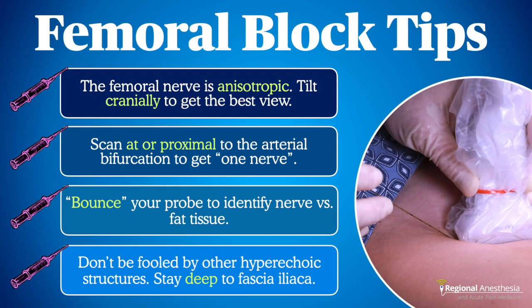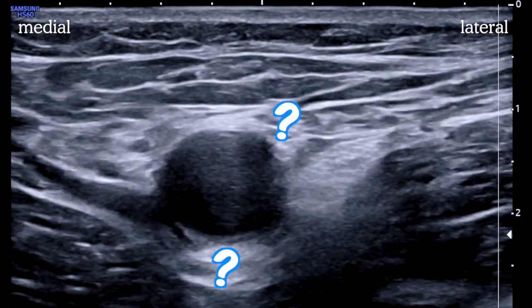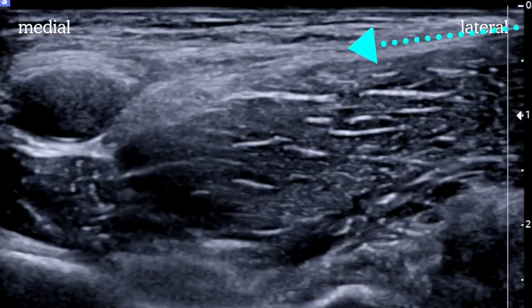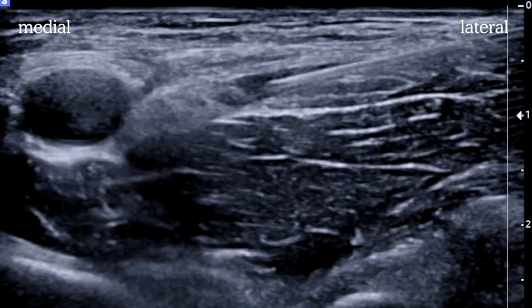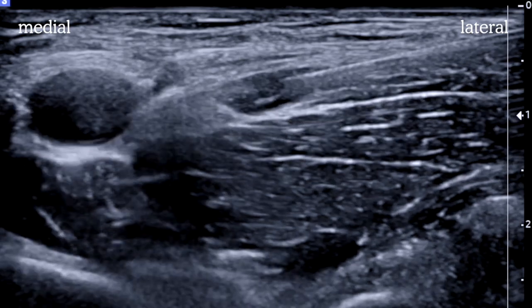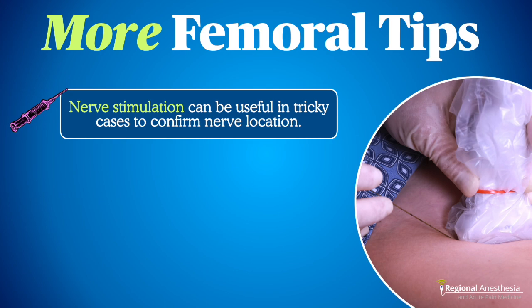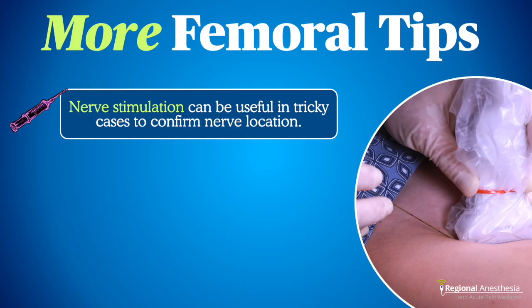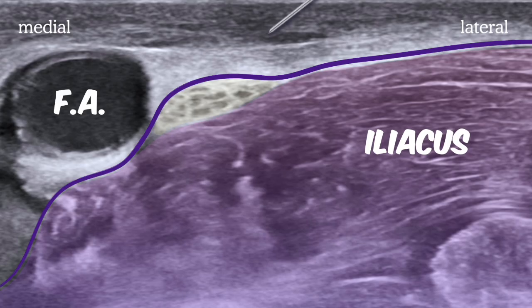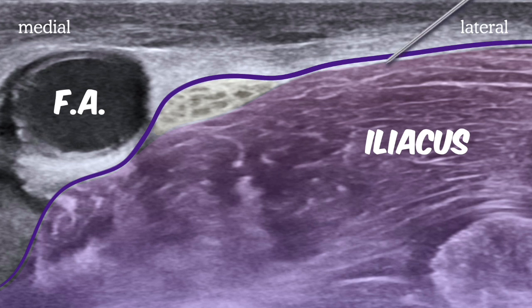Sometimes the nerve isn't exactly where you think it should be, and you can be fooled by hyperechoic artifacts or structures below the artery or in the superficial fat. Just remember: the key landmark is the fascia iliaca. Get some fluid in that potential space and the resulting contrast will pop the nerve out of the background and confirm you're in the right spot. If you're really having trouble identifying the nerve, don't forget nerve stimulation as a useful adjunct. When you pop through the fascia iliaca, don't do it right over the nerve or you'll risk a nerve kebab — pass through more laterally and use fluid to dissect and gently advance to where the nerve lives.